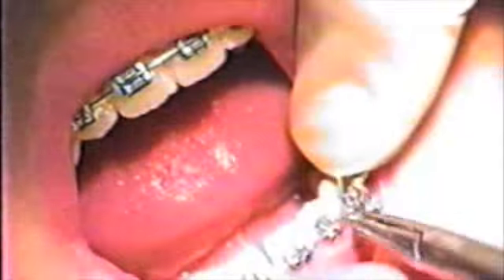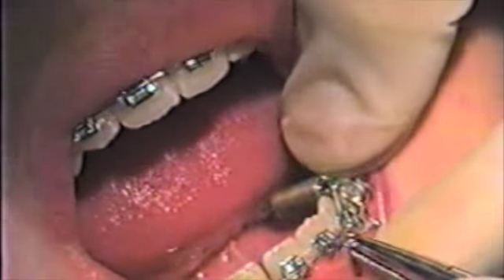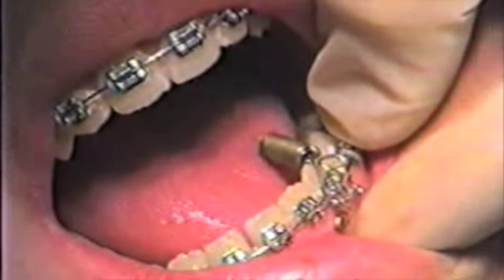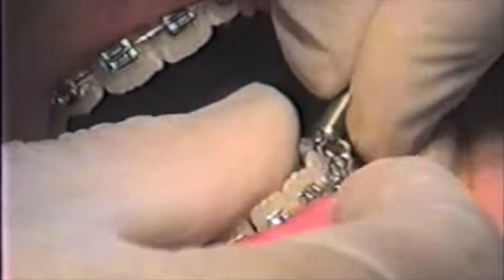These short ligature wires that used to be provided with the safe springs were almost as annoying as not having anything supplied, because they were so short. I would much prefer the longer Kobayashi tie.